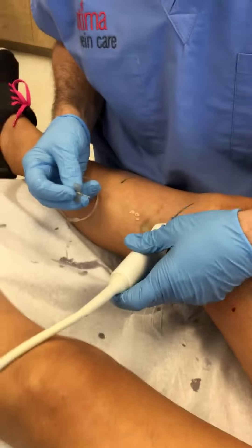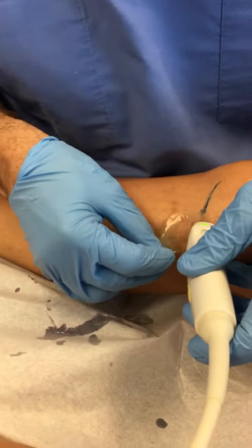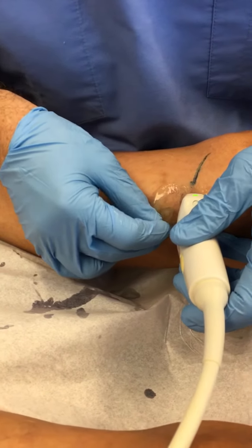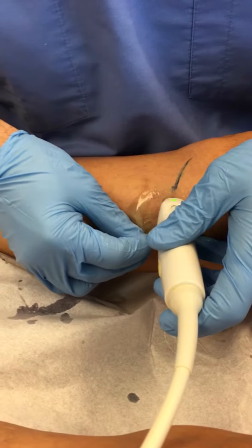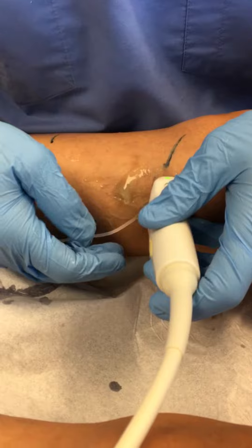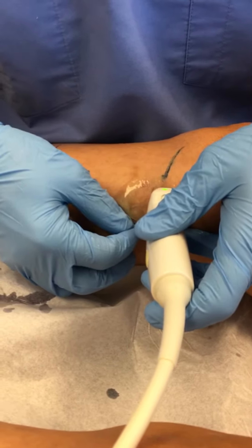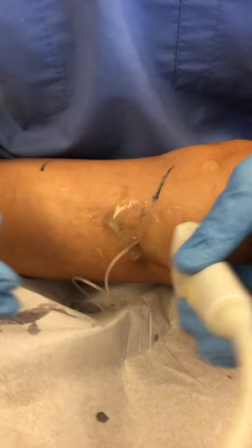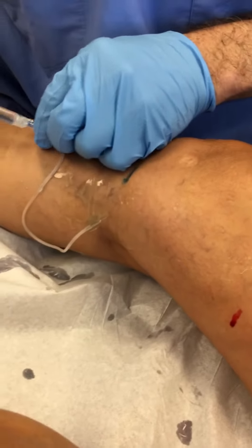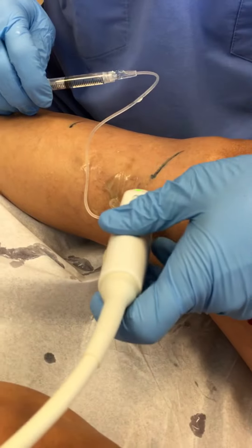This is the best place to get this. The vein might be a little — a little tiny stick right over here. Here I've just put 025. Sometimes these veins have been treated before, so they might have a little bit of debris in them. So sometimes when we put our needle in, it'll catch a little bit of debris.